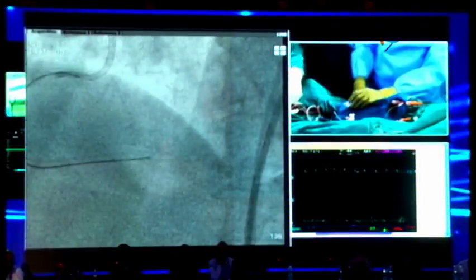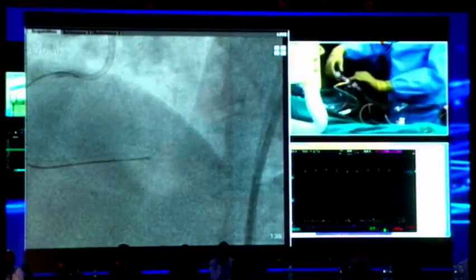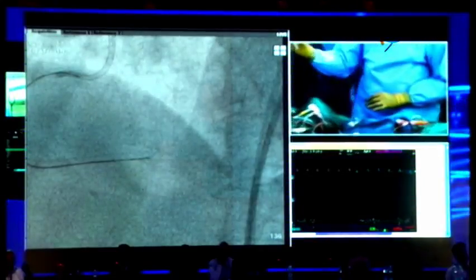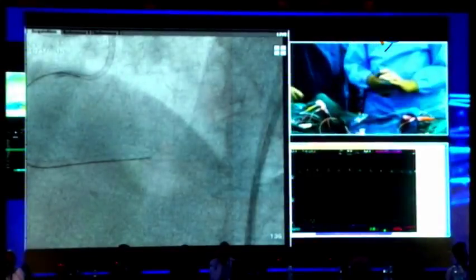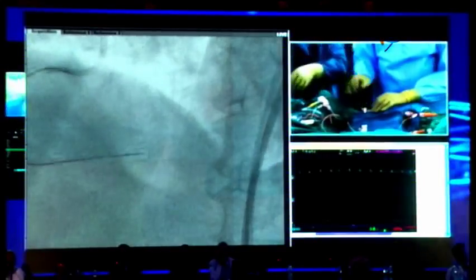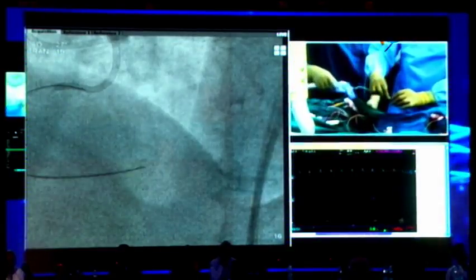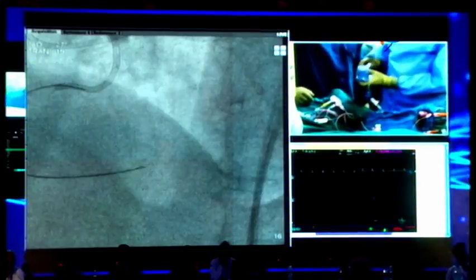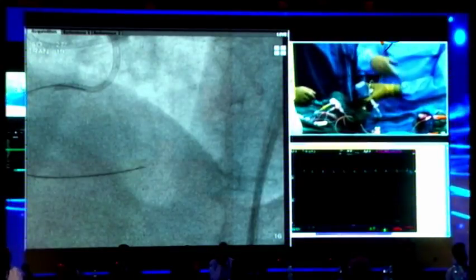So listen, I intentionally took this off. Don't hook it back. So I took no antegrade shots. Okay, good. Ready? Okay, good. So what I want is the inflator, right? That we're going to connect this, and then I'm going to go up on the, okay? So we're going to get all the, no, I know. I want to get all the air out.